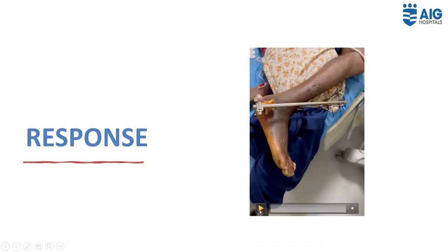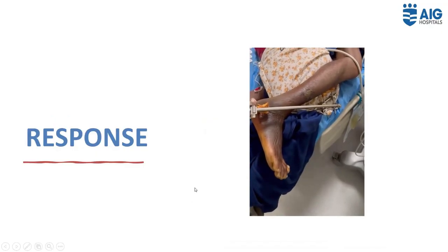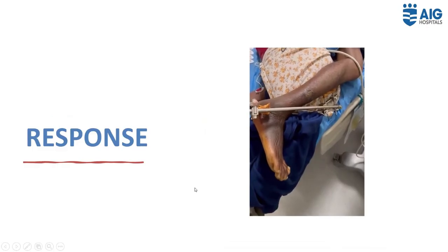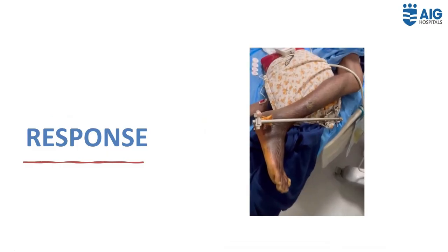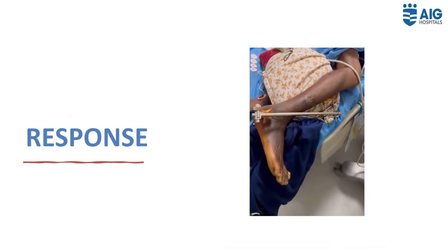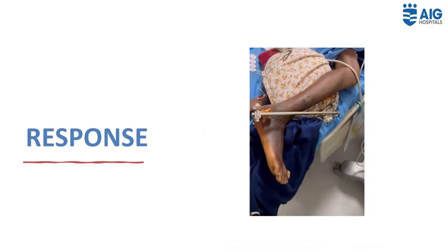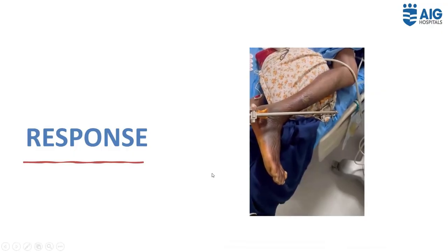Plantar flexion of the foot or toes if the tibial component is stimulated, dorsiflexion or eversion of the foot or toes if the common peroneal component is stimulated. These are the responses sought. The mean depth of the needle insertion is about 7 centimeters, and a volume of 15 to 20 ml of local anesthetic is sufficient.